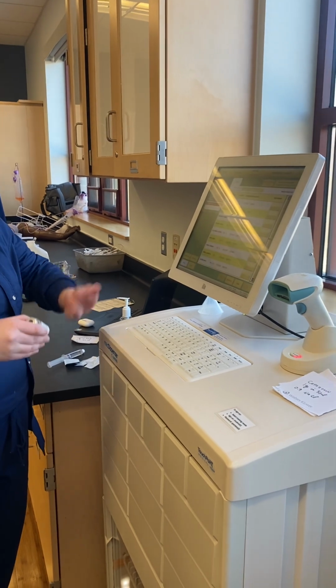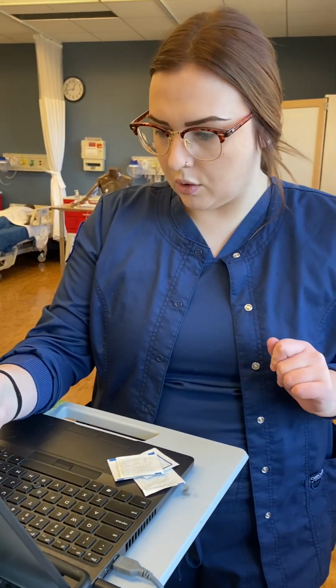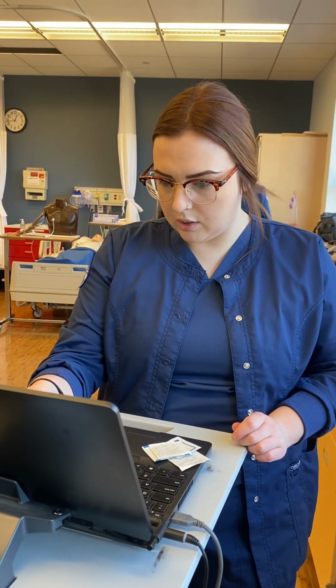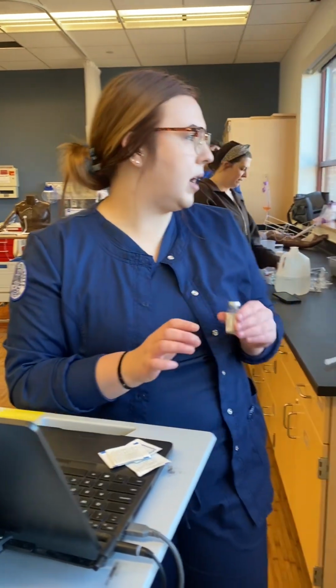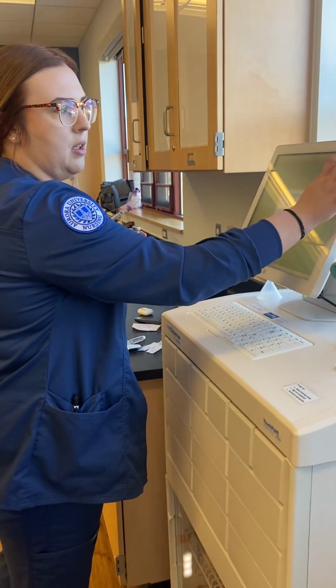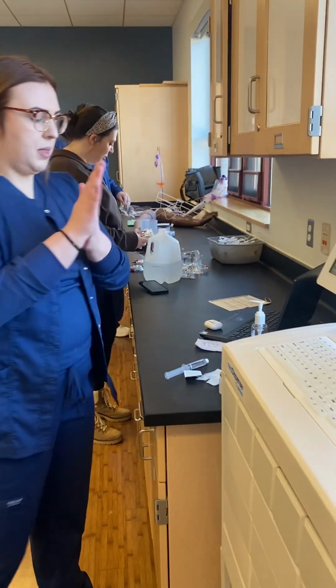Close the drawer. All right, so now I'm gonna double check, or this is my first check. So furosemide, 100 milligrams in 10 milliliters for IV push. Perfect, so I know I have the right med. I'm gonna log off of this right away so I don't forget HIPAA. And now I'm going to draw up the med.